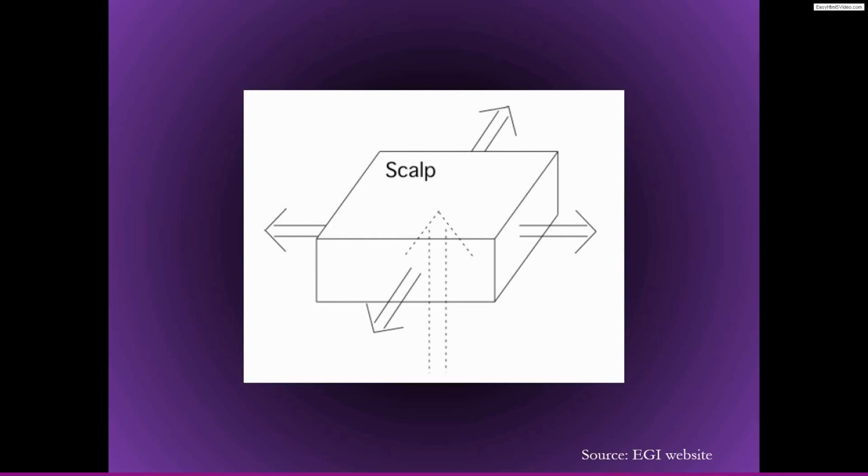Okay, so how does the Laplacian work? We can think about this kind of lateral spread of the electrical potentials at the skull-scalp border. And then we can think about how we might go about addressing volume conduction and subtracting the volume conducted activity from the electrodes.